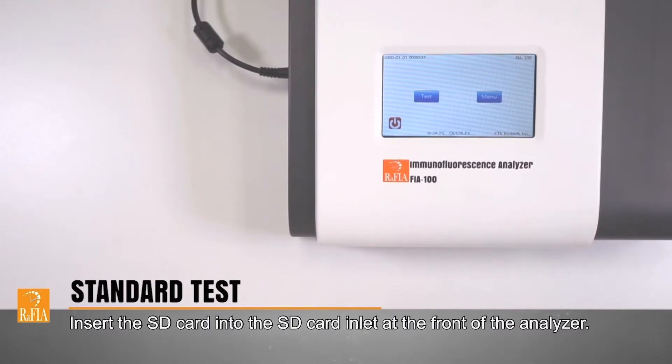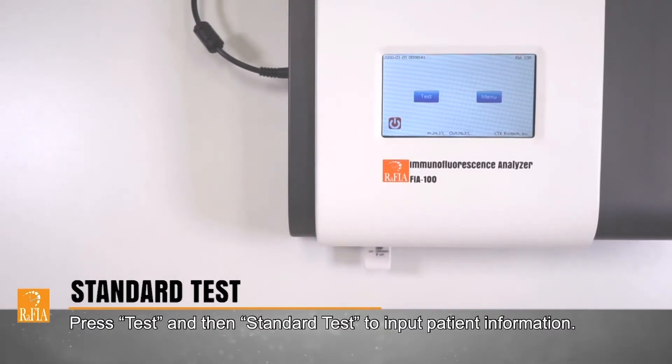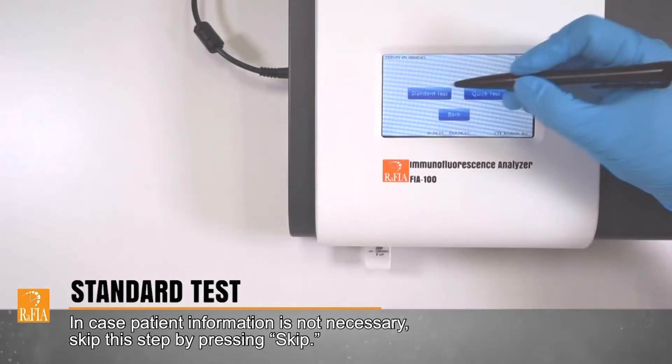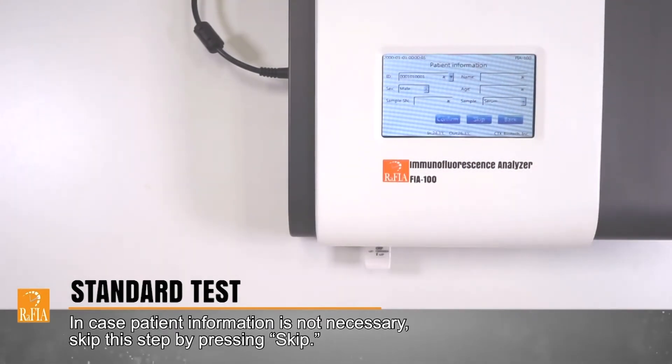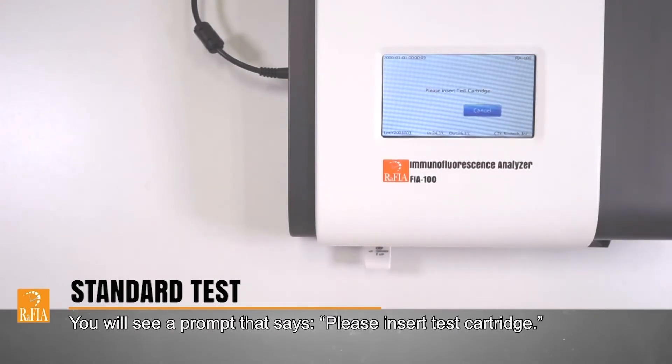Insert the SD card into the SD card inlet at the front of the analyzer. Press Test and then Standard Test to input patient information. In case patient information is not necessary, skip this step by pressing Skip. You will see a prompt that says: please insert test cartridge.